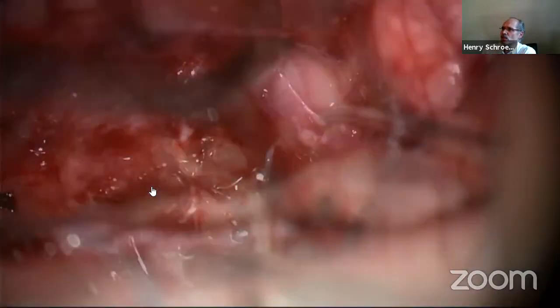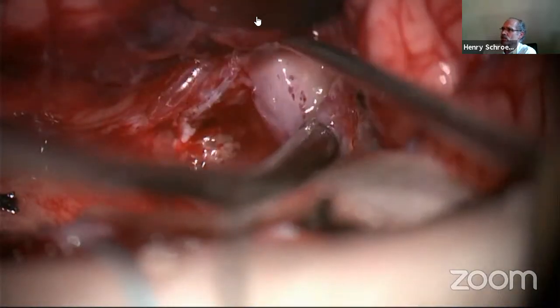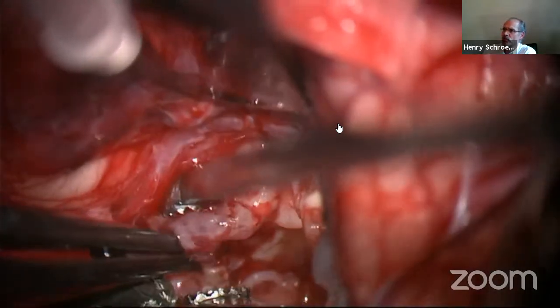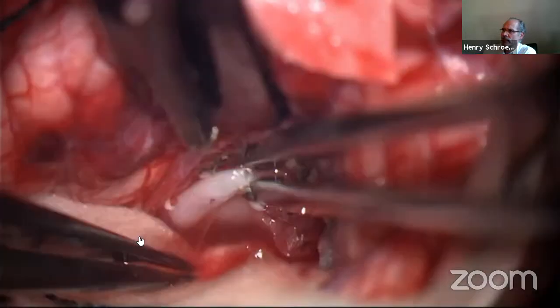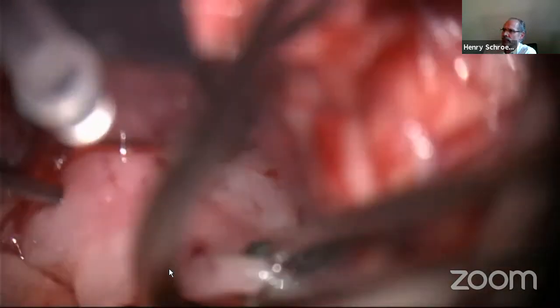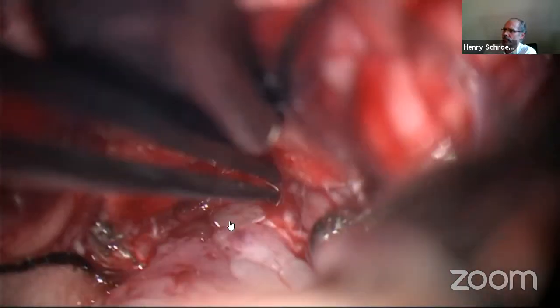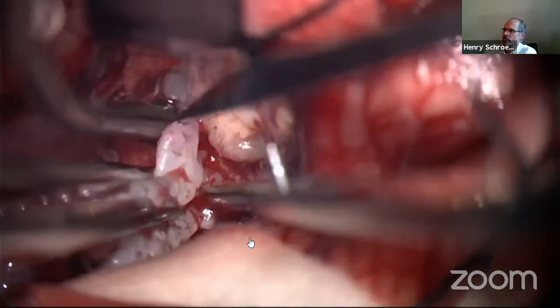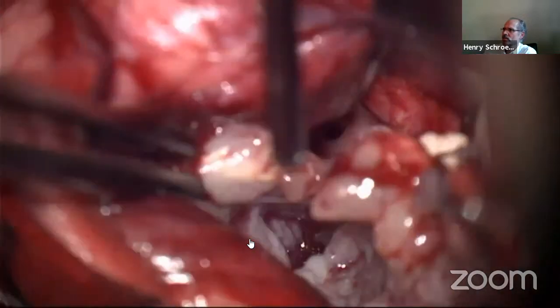And you see now the tumor looks different. There was a yellow thing, very firm, much firmer. This seems to be another type of tumor. Looks different to the tumor which was surrounding. And again, in the foramen, lateral recess on the other side, this tumor is not very sticky and came out easily. Again here, arachnoid plane, choroid plexus plane, dissection, by manual dissection, traction, counter traction.